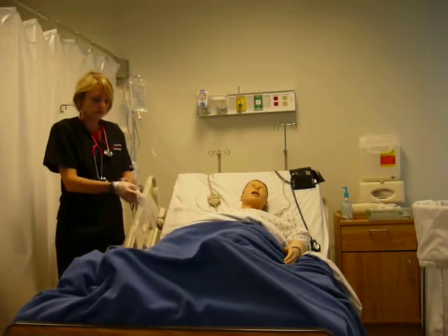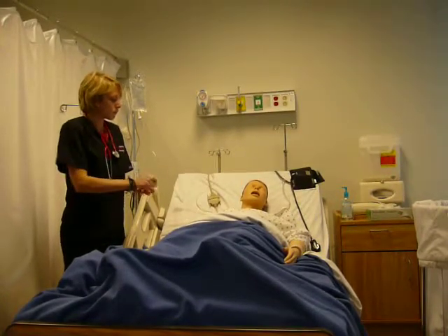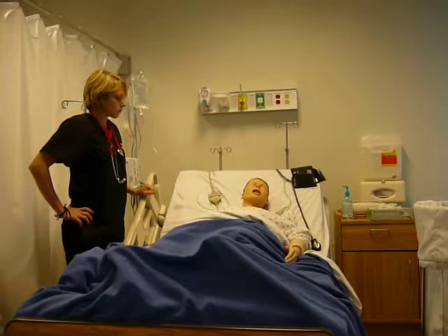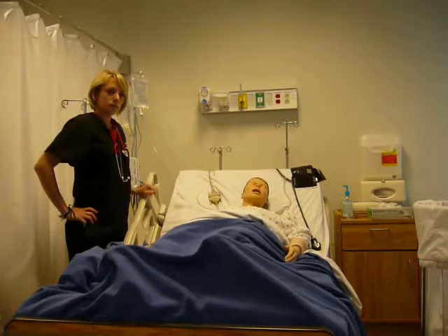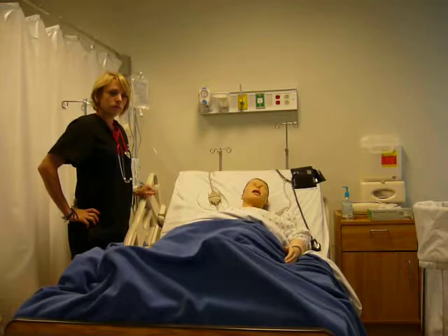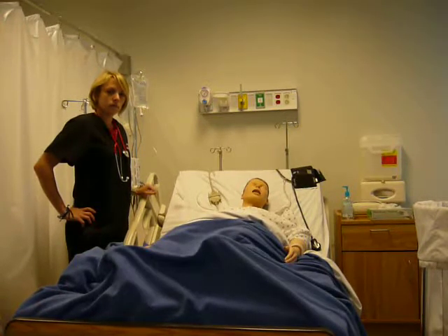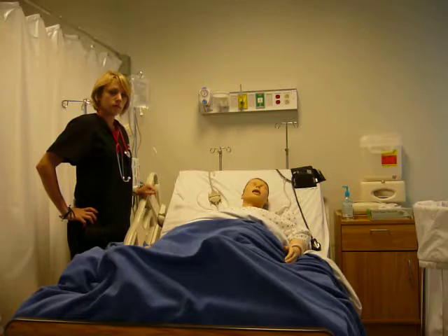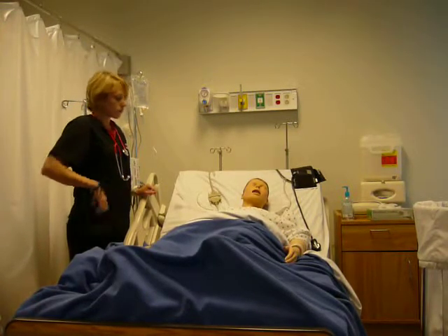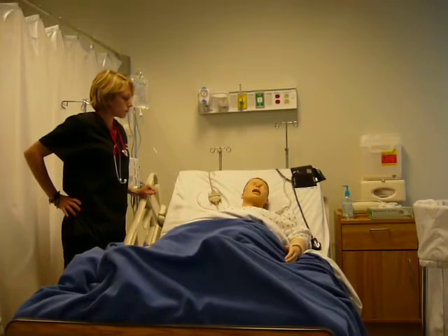You would know that this procedure has been effective when you check the site and it remains free of infection. You have the correct medication given at the correct time, the 5 rights for the patient. The patient has relief of prior pain symptoms, and the patient understands the reason for and functioning of the catheter. They have decreased anxiety, increased ability to cope with pain, pain relief, a dry intact dressing, and no signs of complication, injury, or infection.